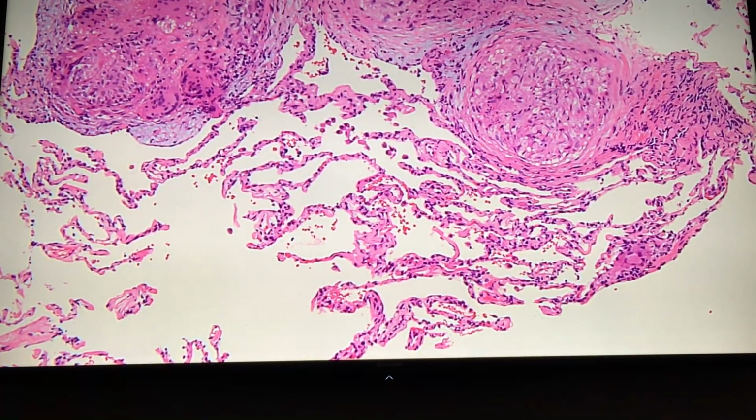In sarcoidosis, the granulomas are interstitial rather than airspace. In sarcoid, the granulomas are well formed rather than poorly formed. And in sarcoidosis, the other thing is that you have a lymphangitic distribution, meaning that the granulomas are along the bronchovascular bundles, interlobular septa, and pleura. But in the transbronch, you won't see that distribution. So that part of it you can't tell.